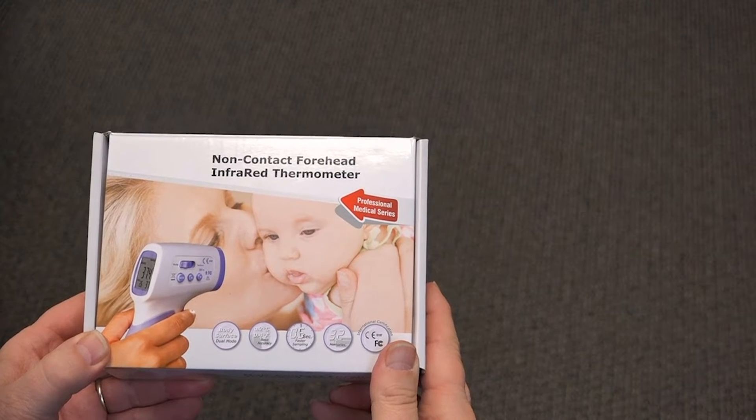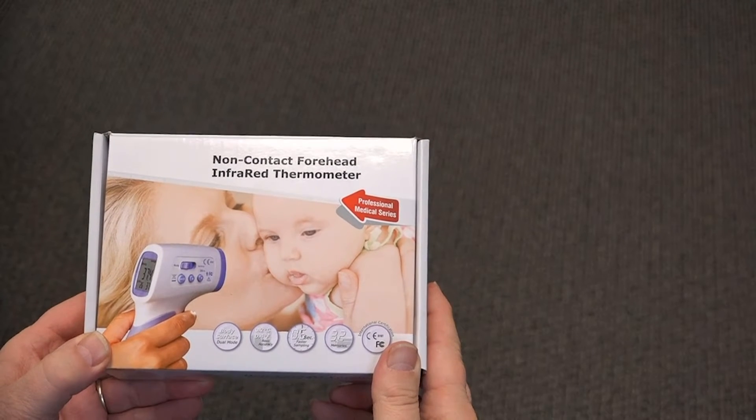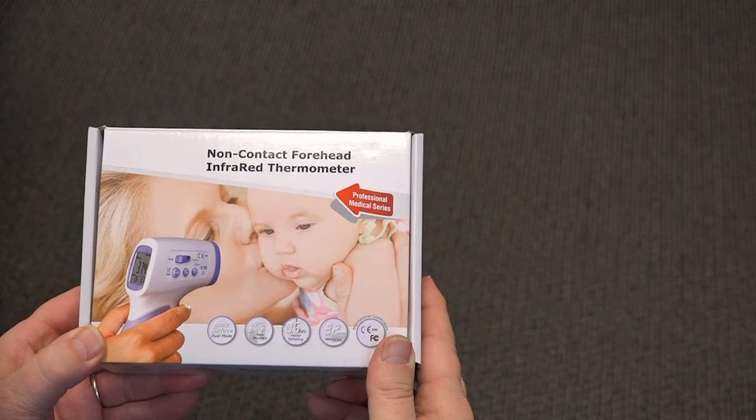Today we're going to demonstrate the setup and use of the DeltaTrax Non-Contact Infrared Thermometer, Model 15004.